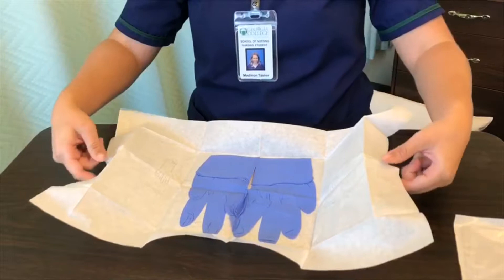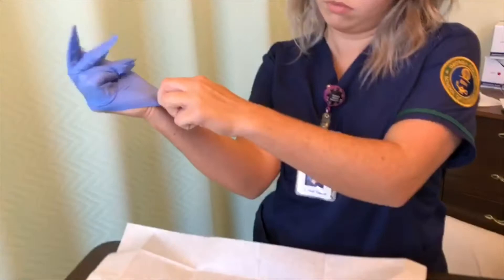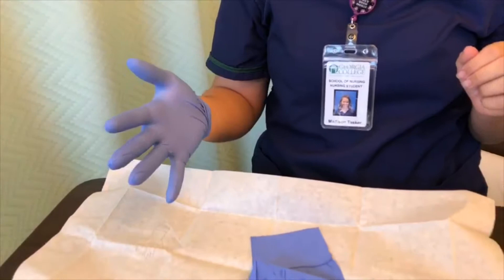Now she is going to use her non-dominant hand to grab the dominant hand glove, making sure to only touch the inside of the glove. She's going to pull it down over her hand. If it's not on comfortably, don't worry — you can adjust it once the other glove is on.